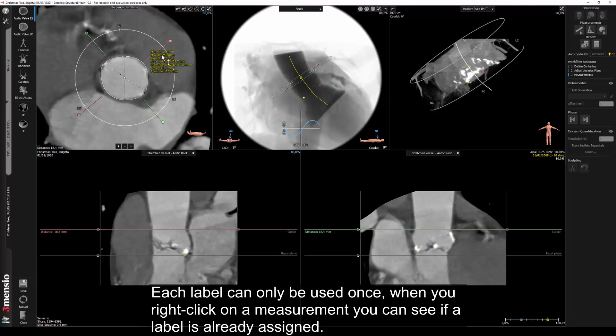Each label can only be used once. When you right click on a measurement you can see if a label is already assigned.